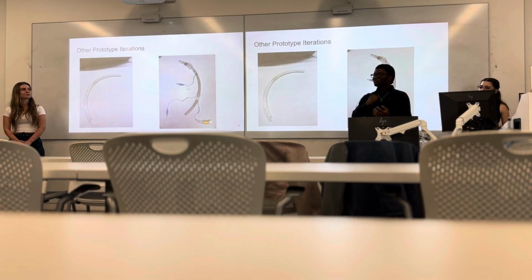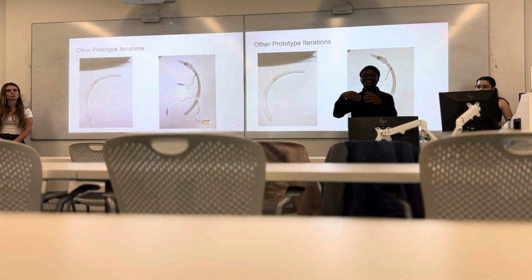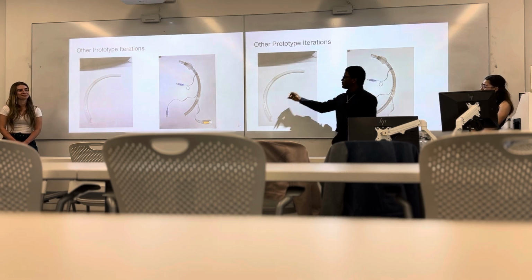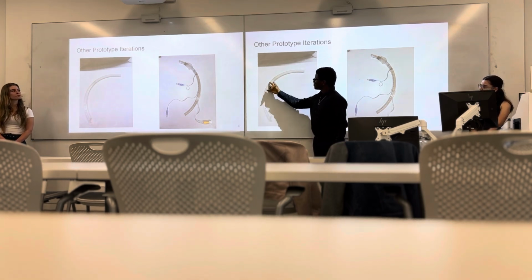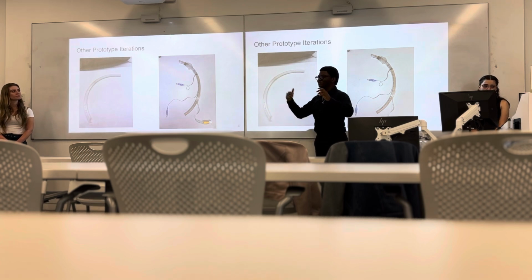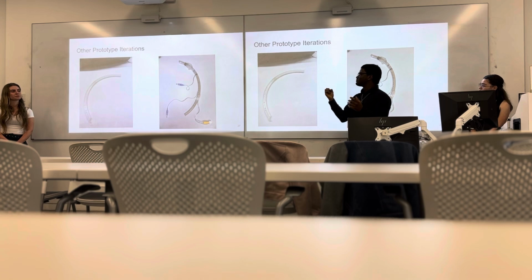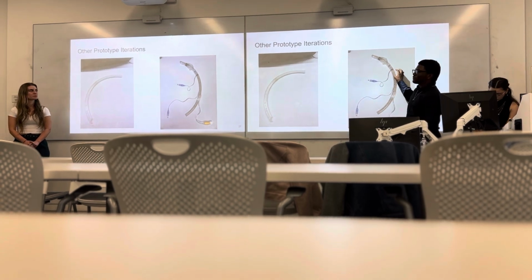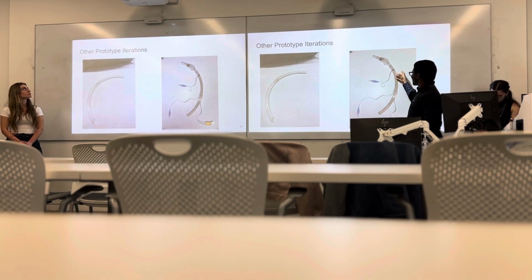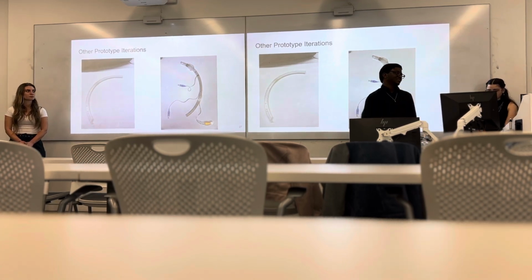However, you need water to remove the inside support material. It removed the support material at the ends, but since there are no holes to allow the water to constantly flow, the material in the middle got really stuck. When we tried to remove it, it just didn't work out. So we then decided to primarily focus on working with the actual tube and just adding an extra catheter to show a proof of concept.